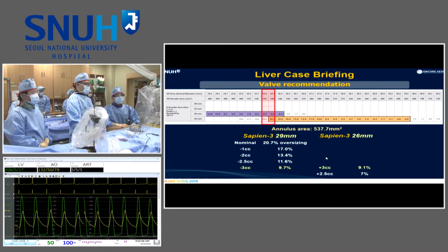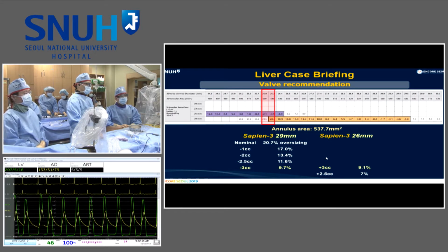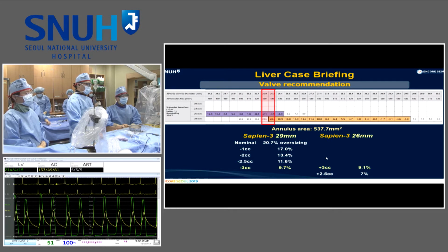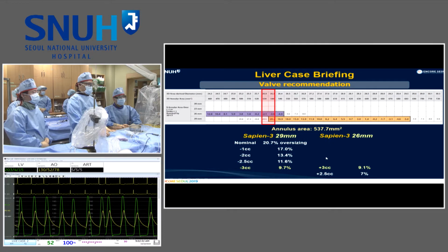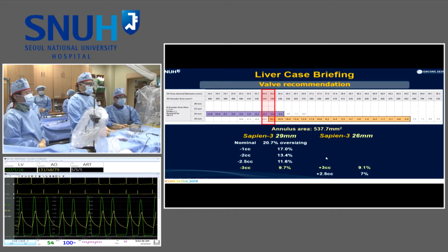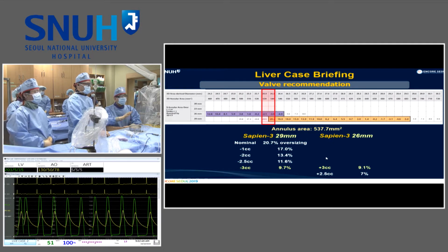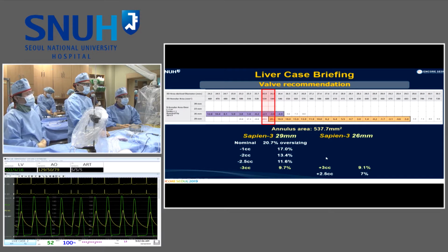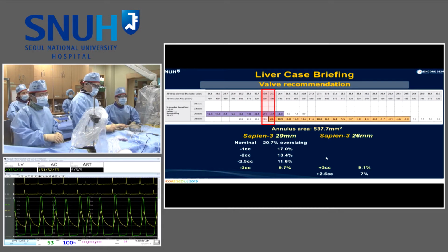Yeah. Regarding the Lotus Edge system, I prefer Lotus Edge for these patients, but Boston Scientific cannot provide Lotus Edge at this moment. In South Korea, I experienced one case of Lotus Edge last month, but there is a shortage of proctors around the world, thus they cannot provide a proctor. I can do Lotus Edge by myself. They agree with me because I was a proctor of the traditional Lotus system, but my colleagues are not accustomed to Lotus. Thus they insist we have to undergo 5 cases with a proctor. We just finished one case of Lotus Edge with a proctor, thus I was not able to prepare the Lotus Edge system for live demonstration. Okay, anyway, you recommend a little bit smaller size of valve.